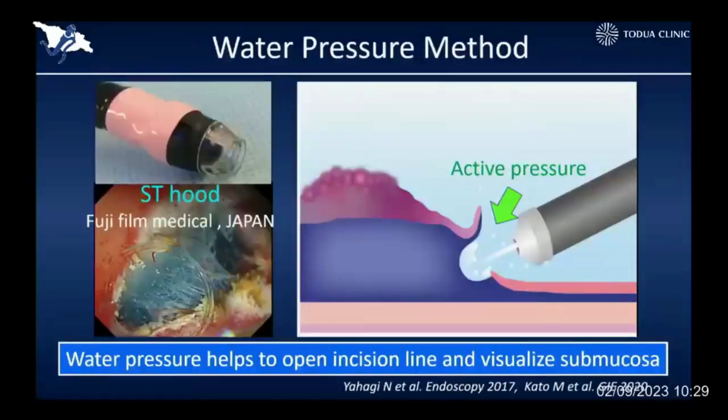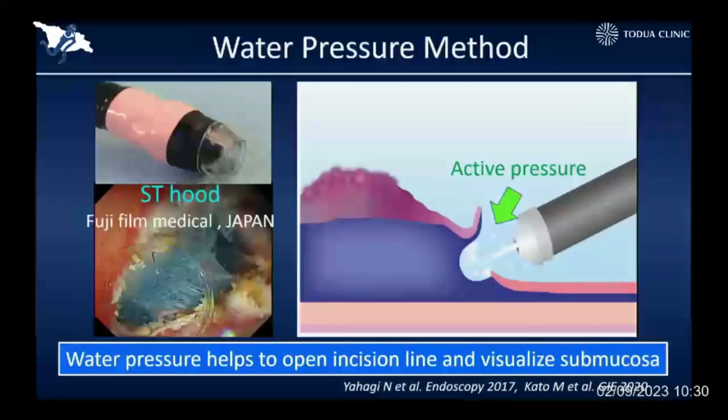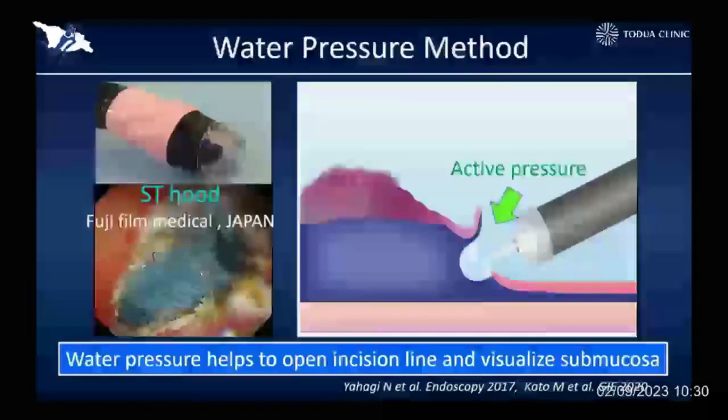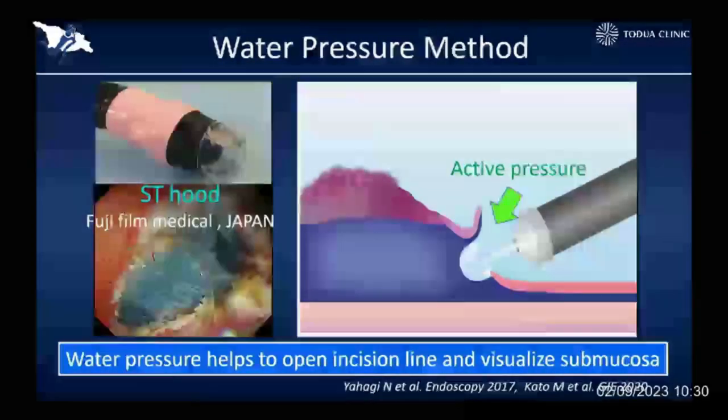We ourselves developed another technique, which is the water pressure method. By using the active pressure of normal saline, we can easily open the submucosal space — we don't need any traction device. By giving active pressure to the inside of the area, I can easily open the submucosal space. By using the water pressure method, we can do really aggressive endoscopic resection.